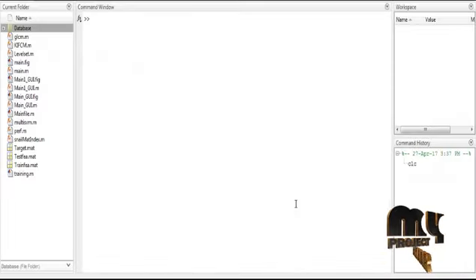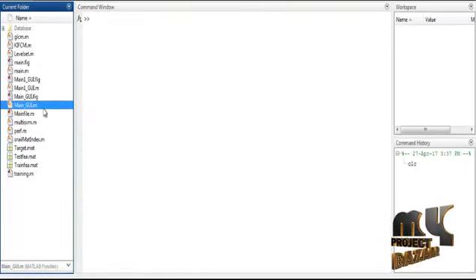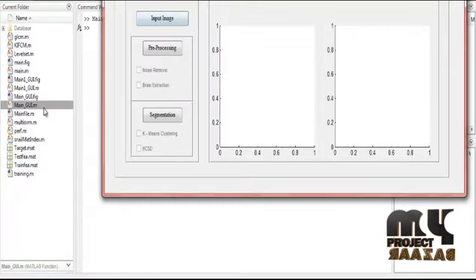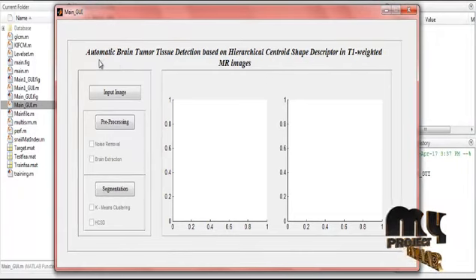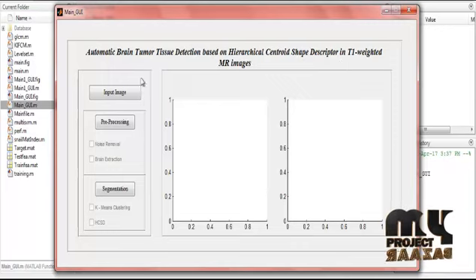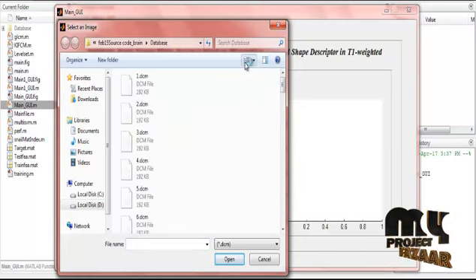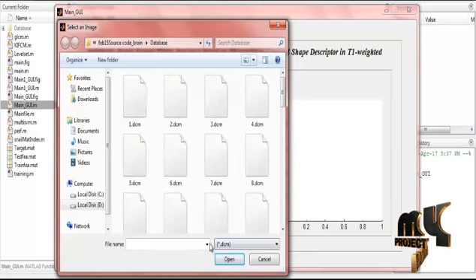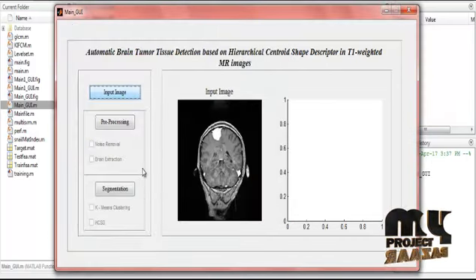Let us discuss the running procedure. Click the main GUI and then run. This is the main GUI design. The process is Automatic Brain Tumor Tissue Detection Based on Hierarchical Centroid Shape Descriptor in T1-Weighted MR Images. First, click the 'Input Images' button. These are the database images — different types of images are present. I will select the fifth image and then click open. The input image is displayed, and then we proceed to the pre-processing step.